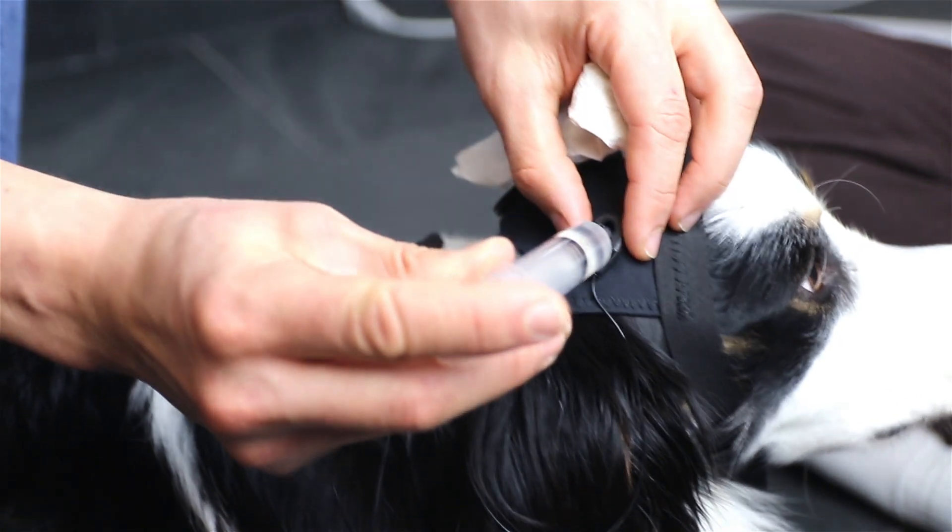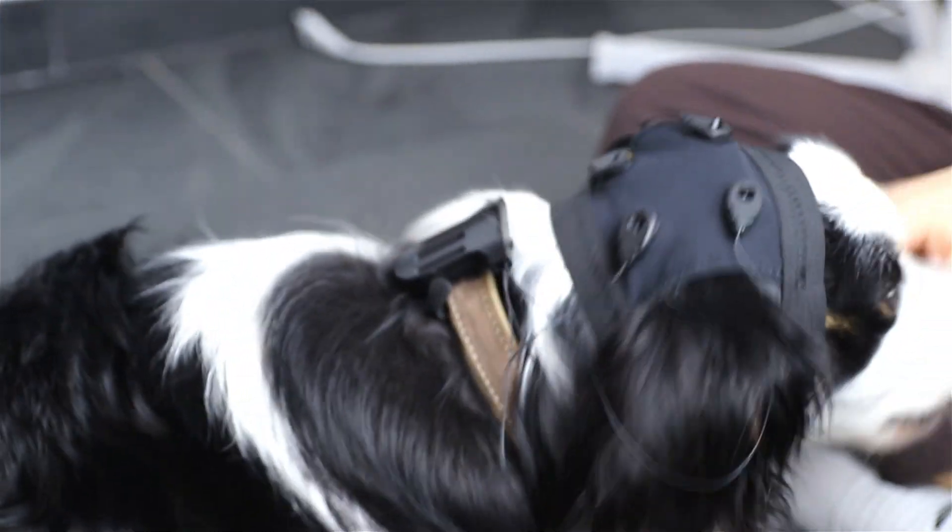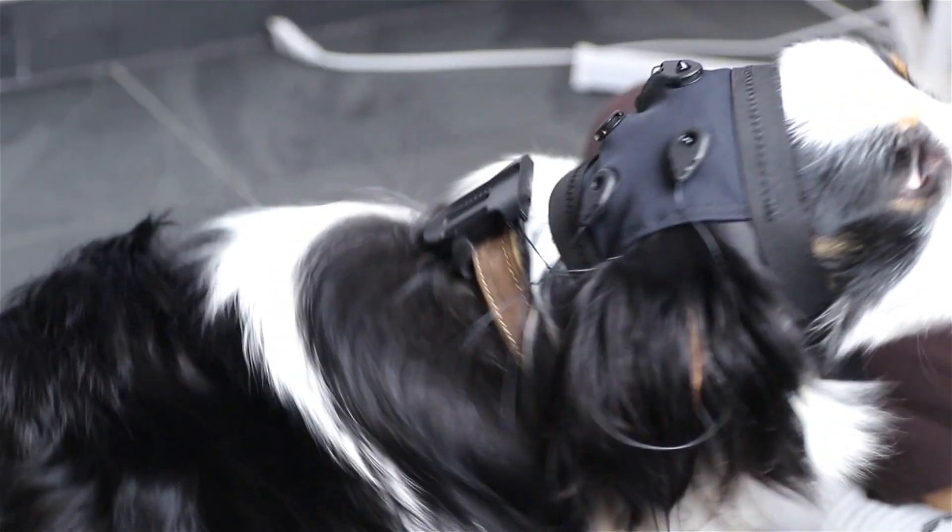Carefully fill each electrode with an appropriate amount of gel to ensure optimal conductivity and reliable signal transmission.